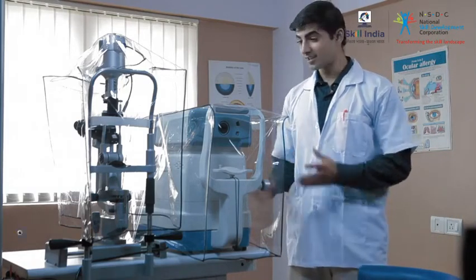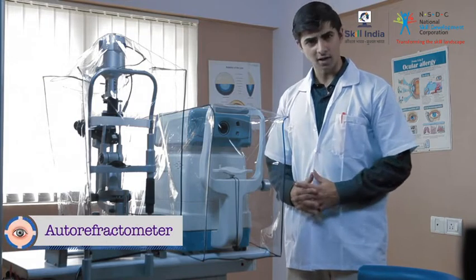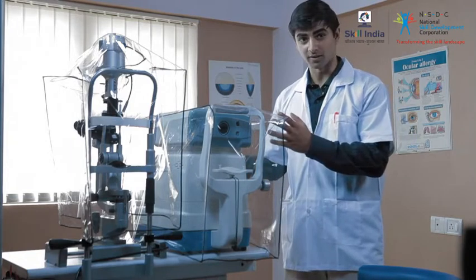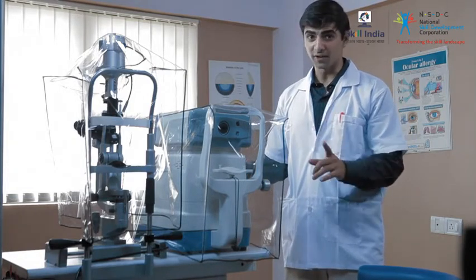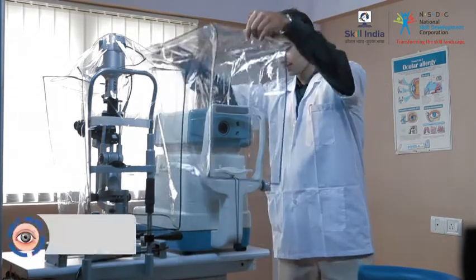Our next instrument is the auto refractometer. Are you wondering why it is covered? Well, it is a very sensitive instrument, and you must remember to cover it every evening at the end of the day. Step 1: remove the cover from the auto refractometer.